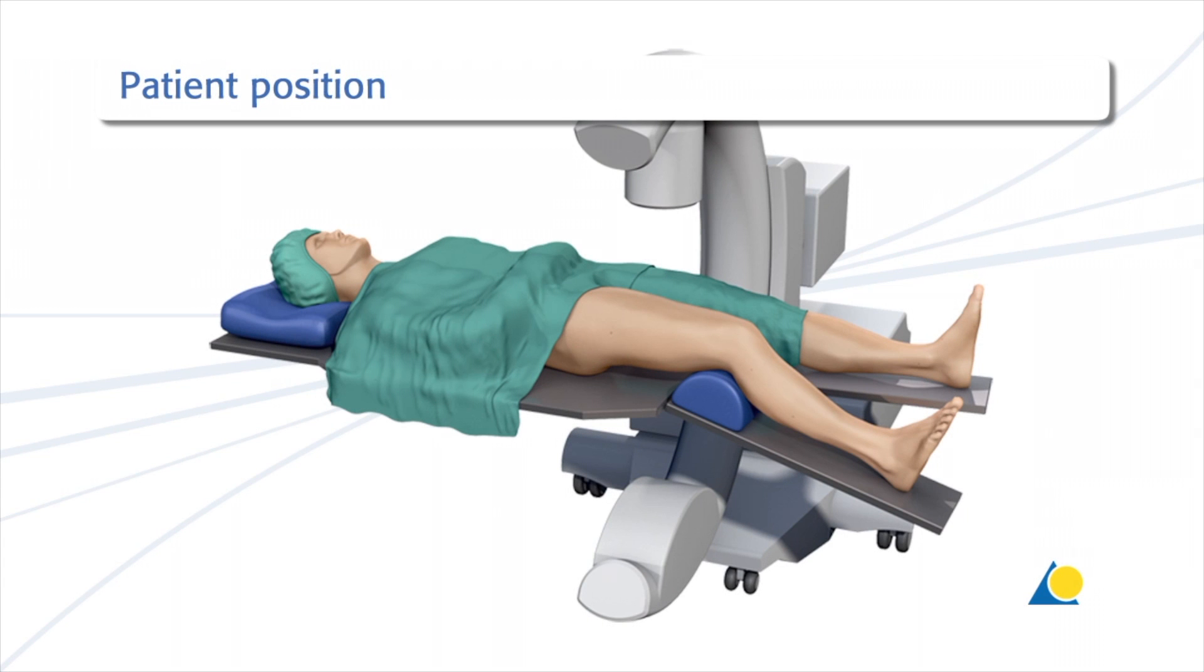To help in the reduction of distal femur fractures, the knee should be placed in flexion in order to relieve the tension of the gastrocnemius muscle. The positioning must allow radiological examination in both planes. This can be achieved either by raising the other leg so that the injured leg can be approached from the side, or if possible, by lowering the other leg from the hip.